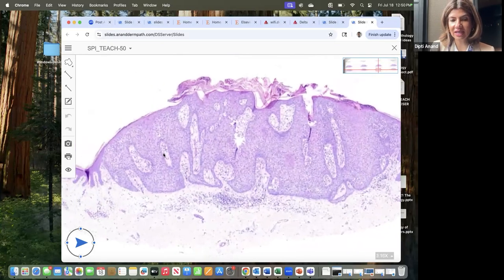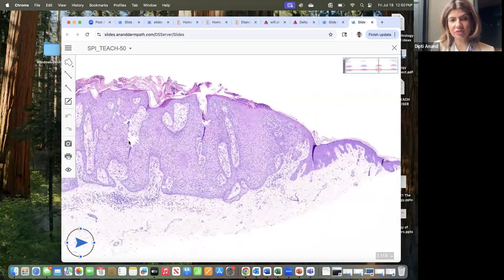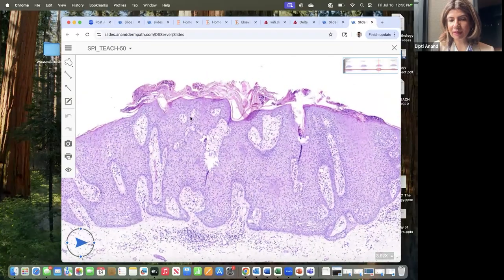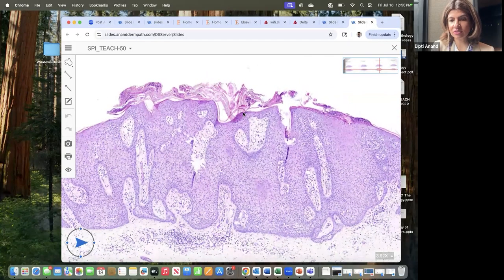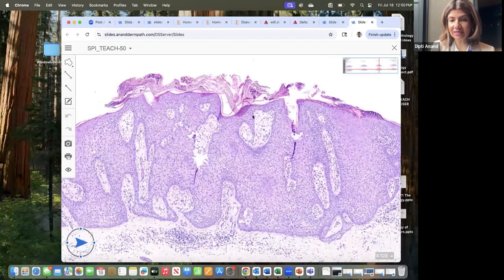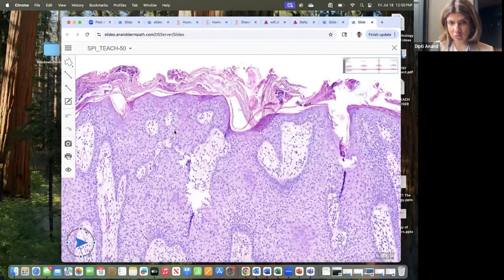And it has a nice psoriasiform acanthosis. It's sharply delineated from the surrounding epidermis, and you can see the massive suprapapillary thinning with these dilated vessels. So you see all the dilated vessels with the suprapapillary thinning. These dilated vessels will actually produce the classic dermoscopy finding of the string of beads appearance. It's pretty classic on your dermoscopy.